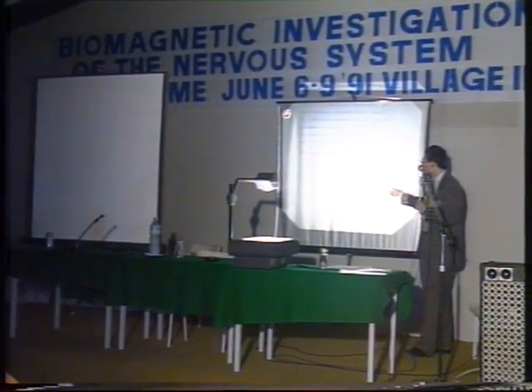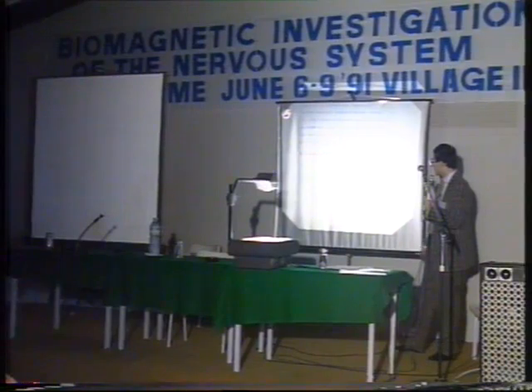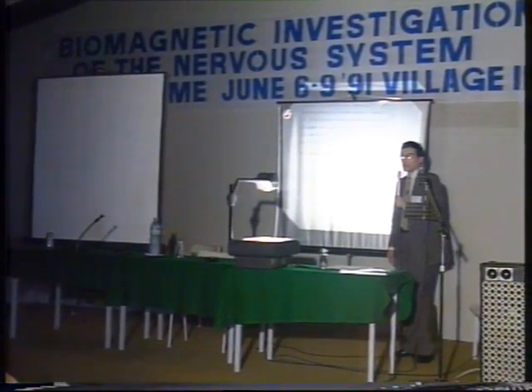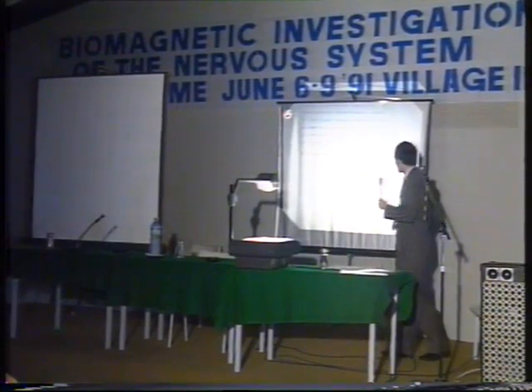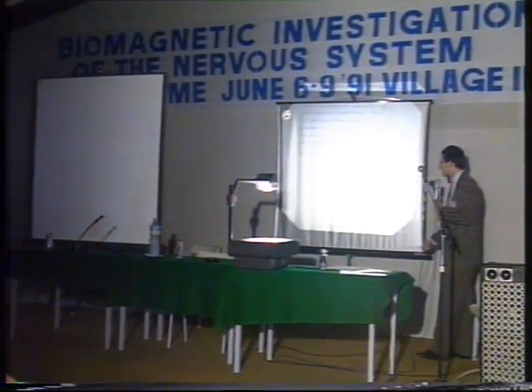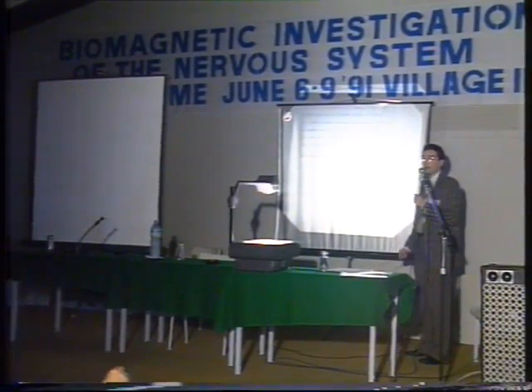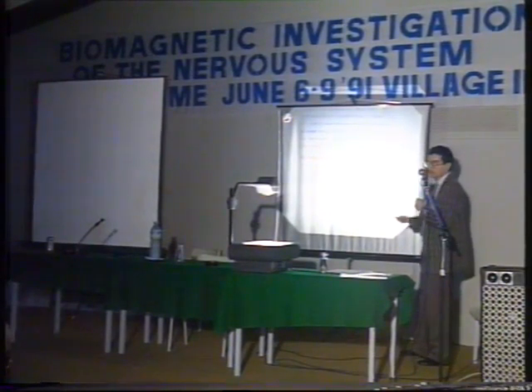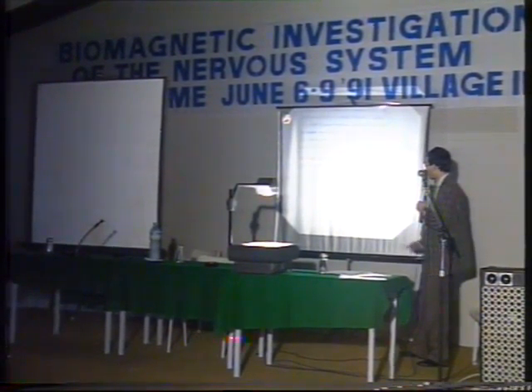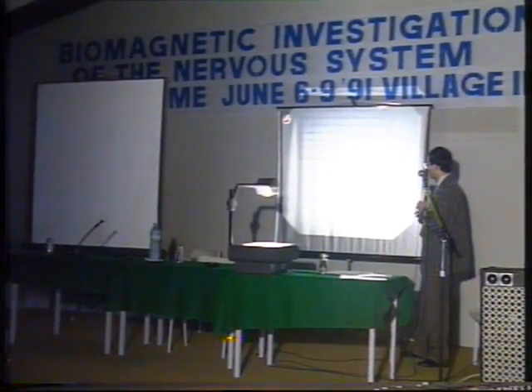We usually covered almost the whole head. We left out only the occipital region because it's not of interest, and also it's the difficult part to map, especially on patients. But anyway, in this case, we don't have problems because we can leave out this region without having problems in source localization.